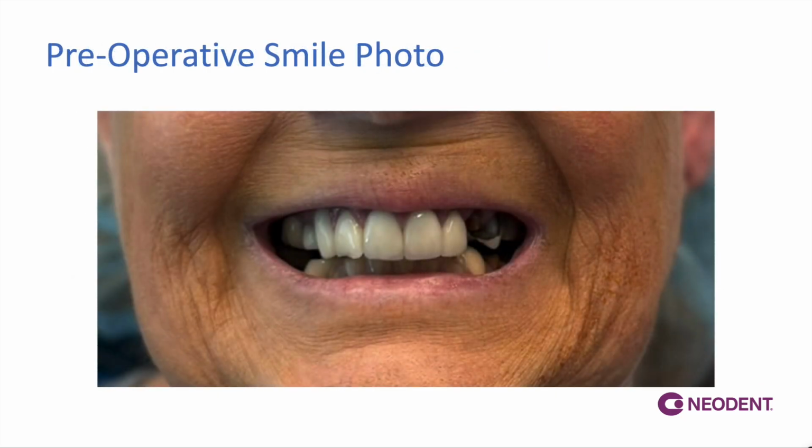Here is a preoperative smile photo. This is the maximum amount that she can smile. We asked her for a very large reveal that she could give us, and so we do not have a very high smile line in this case. So the risk assessment here for a high smile line is very low.